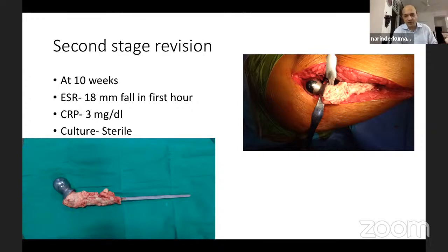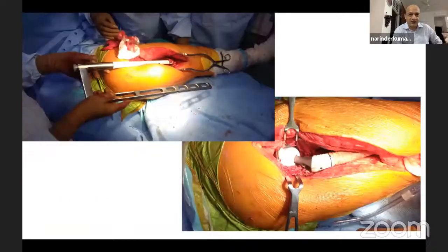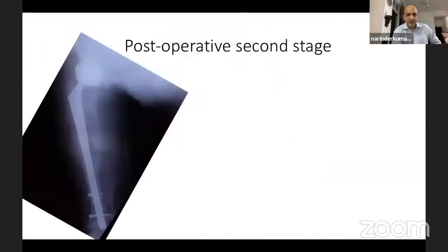This is what we removed. And if you see here, you can see that antibiotic socket, the cement socket, which is antibiotic loaded. And this one had a little bit of an acetabular defect, which helped so that the femoral head ball didn't go into the pelvis. The cement socket prevented it. And we used a reef to revise this. There was no way I could have done anything else, probably.